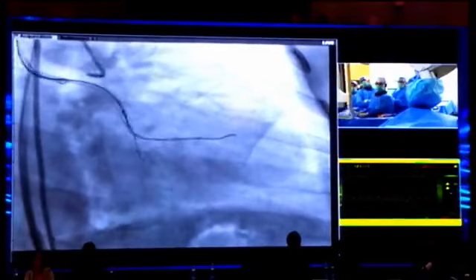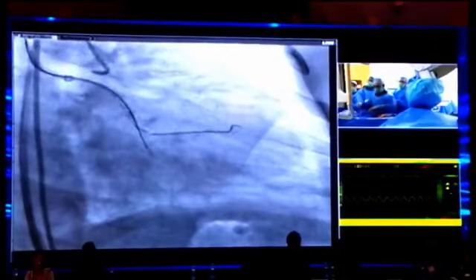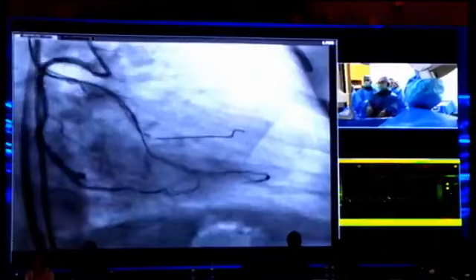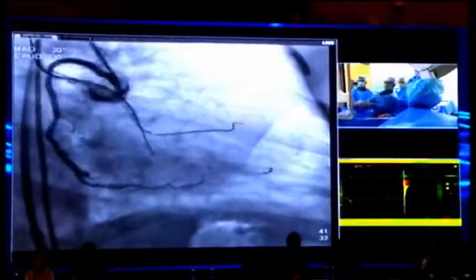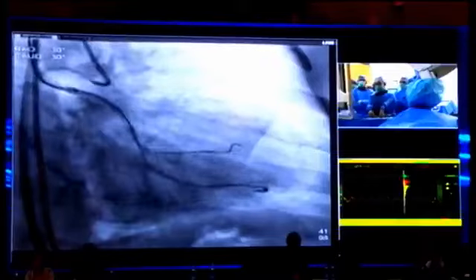I think, yeah, I don't know. I think it's fragmental. Okay, that's it. But it's looking like subintimal. I think we need to see in some other view. Yes, some other view. Okay, please change to the yellow color, complete.